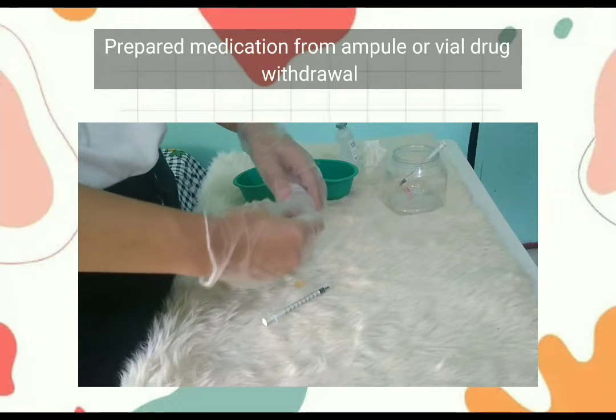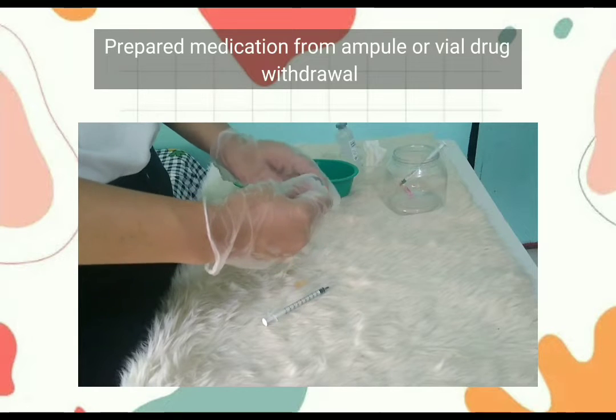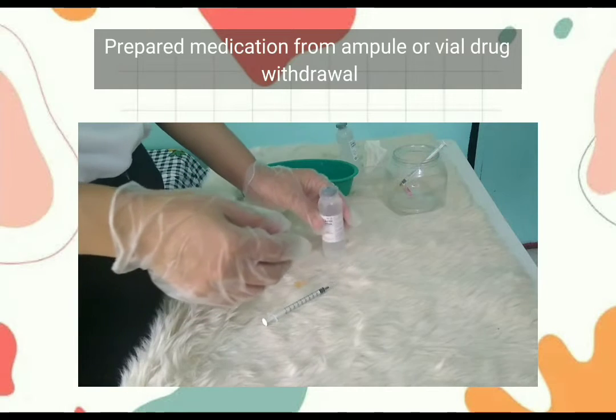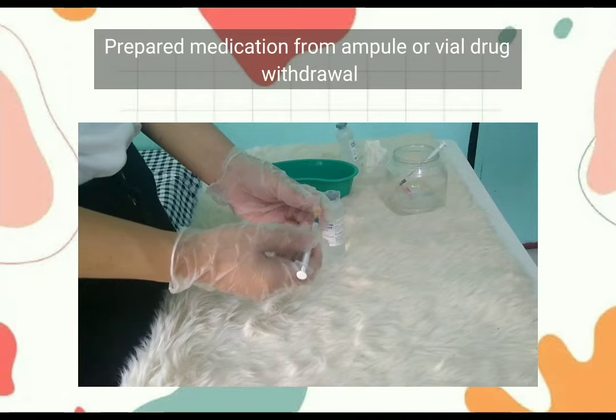And we are twisting this, removing and disposing it. And putting the cup in the syringe.